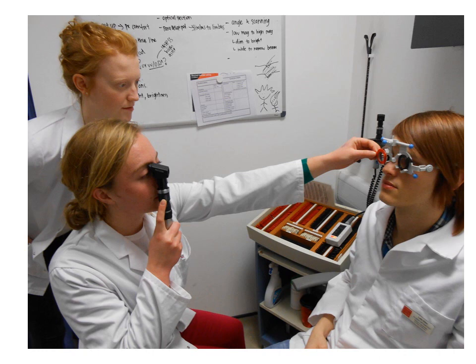This is a diagrammatic representation of the distance at which the examiner should sit from the patient, and the patient is asked to look at a distant object, like in a dark room. Snellen's chart will be the distant object, and the patient is asked to look at the Snellen's chart as and when you are doing retinoscopy.